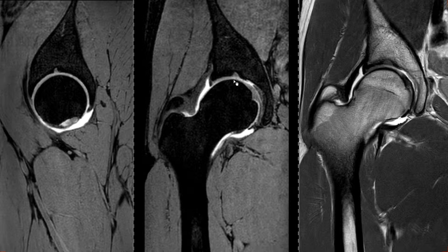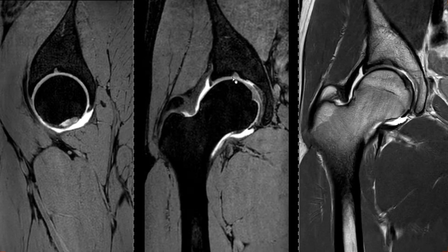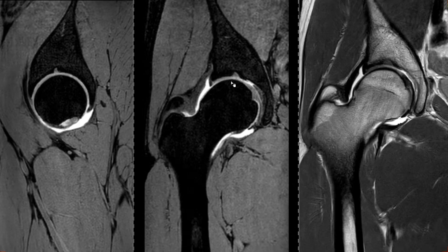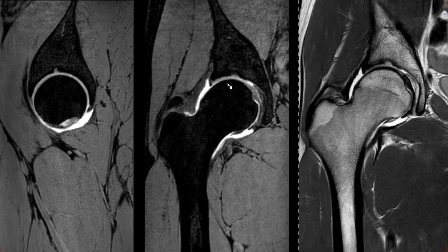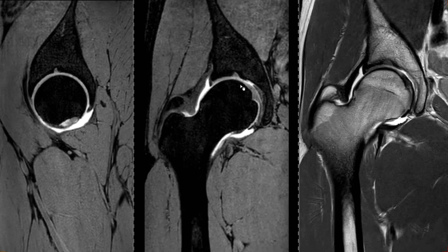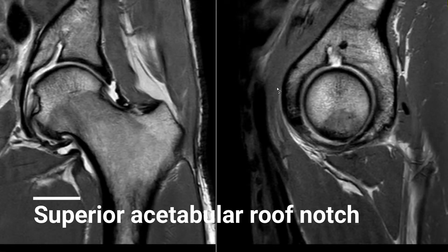If you observe several patients over a long period of time, you can sometimes see that a type 1 fossa eventually becomes a type 2 supraacetabular fossa — it eventually fills up with cartilage. That's at least one of the newer theories. It's a normal variant and it's present in up to 10% of all hip exams. Be very careful not to call this an osteochondral defect or osteochondrosis dissecans or any other pathology, because it's just a normal variant.